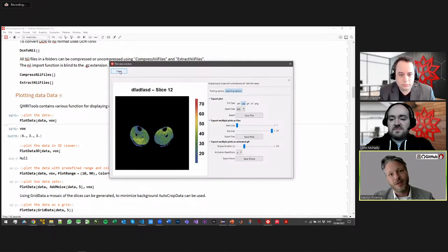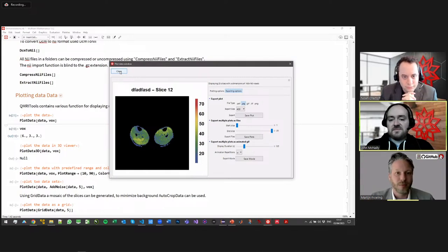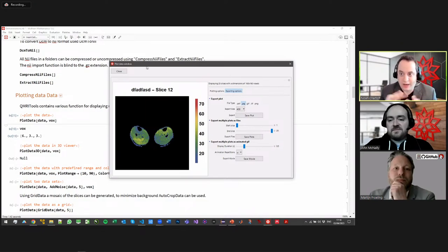So then these values are arbitrarily scaled. Typically, they are 12-bit or 16-bit integers. And once we do computation on it, these models can, for example, give water fat fractions in percent. So then all of a sudden, these numbers do have value. Then we go from qualitative data to quantitative data. That's after we apply all the models, and then these values will have meaning, and therefore color bars. So typically I use grayscale if I look at qualitative data, and color bars if I look at quantitative data. So right now all it's measuring is brightness of the image.